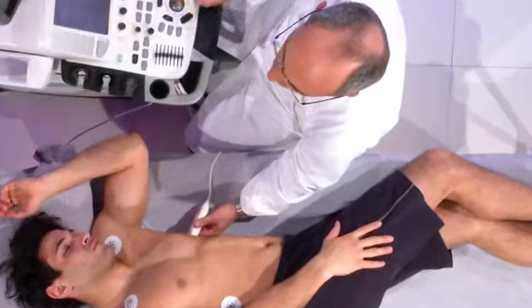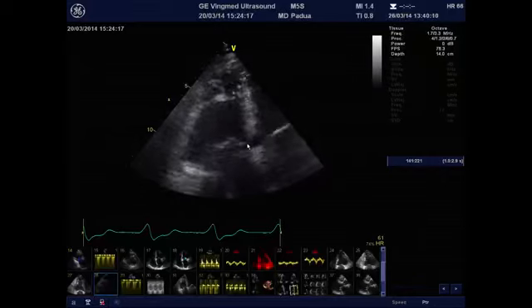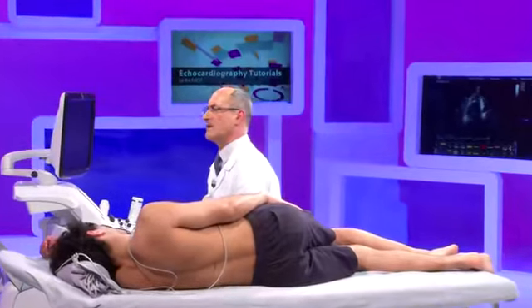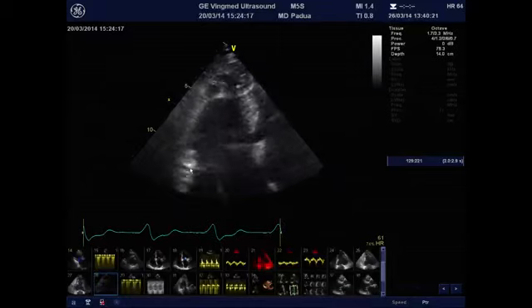Again, this may not be an issue if it was already like this before, but it may be a real issue if it is a new finding during this particular examination. It's not very useful in patients with heart transplant to measure the TAPSE. This is usually done routinely, but as in any other patient with previous cardiac surgery, the TAPSE is quite misleading. It can be abnormal even if the systolic function of the right ventricle is normal.